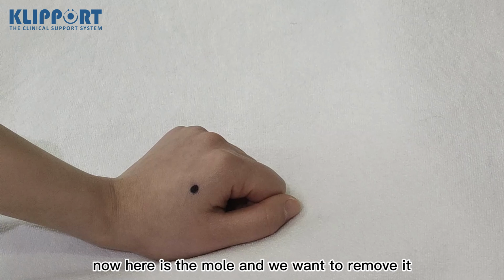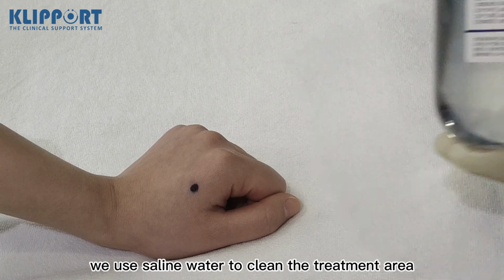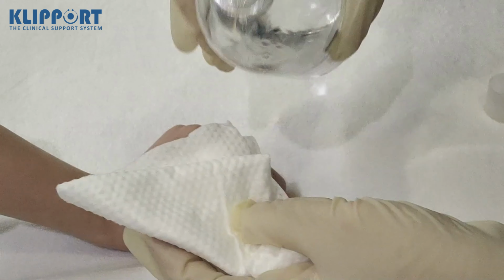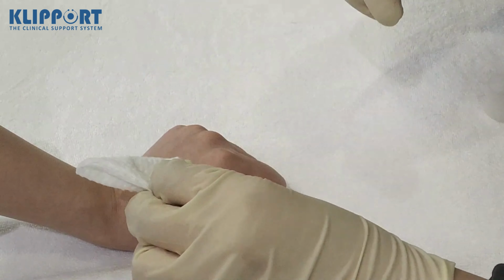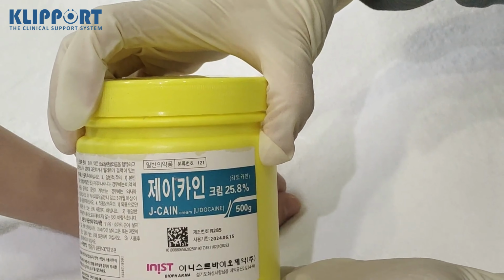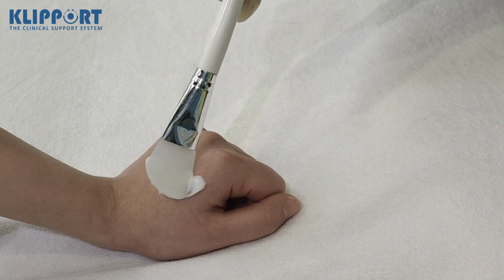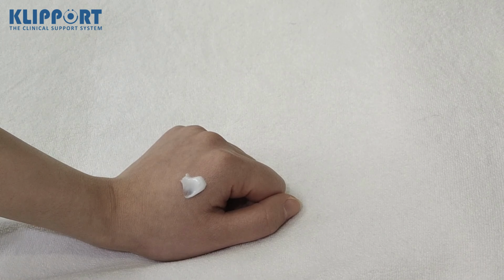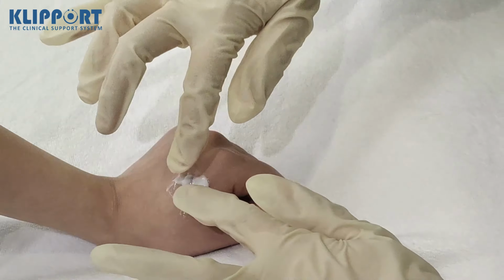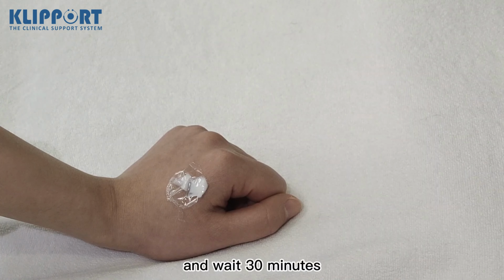Now here is a mole and we want to remove it. After we change the surgery handle, we use sterile water to clean the treatment area. And then we need numbing cream. Apply it on the treatment area. And then we use plastic film to cover the numbing cream. And wait 30 minutes.